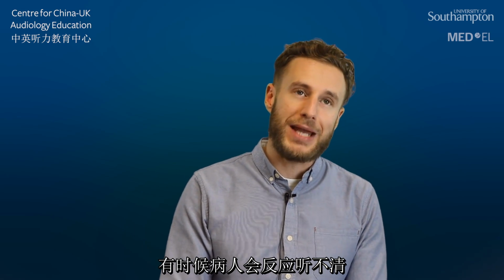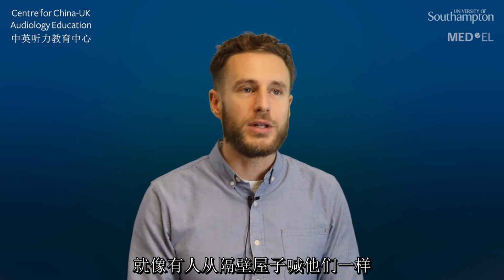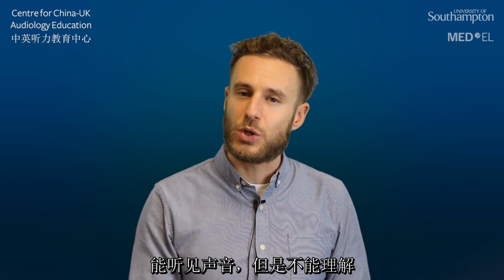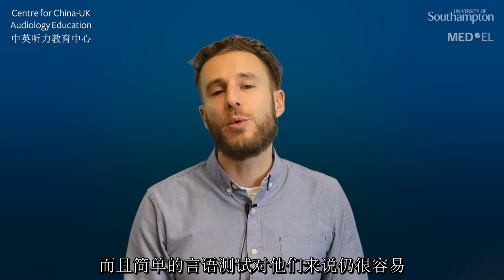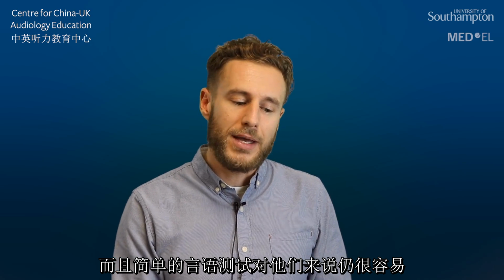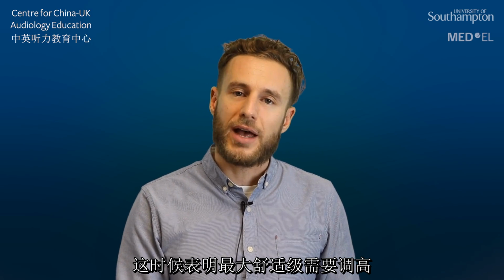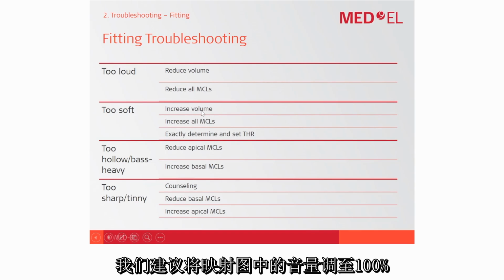Especially if patients report that auditory sensation is muffled, or some of them report that they have the impression someone is calling them from the room next door, so they hear it but they can't really understand, although they would perform quite well in an easier speech test setup, then this could indicate that especially MCLs are not adequate, are not high enough. We also recommend to keep the test volume and also the activation volume in a live map close to 100%.